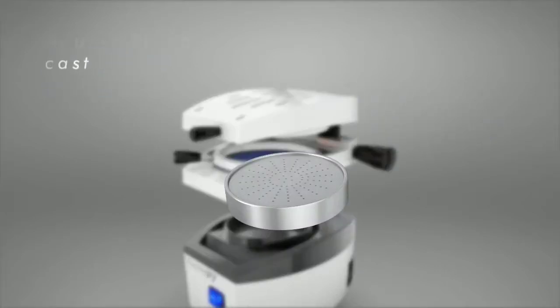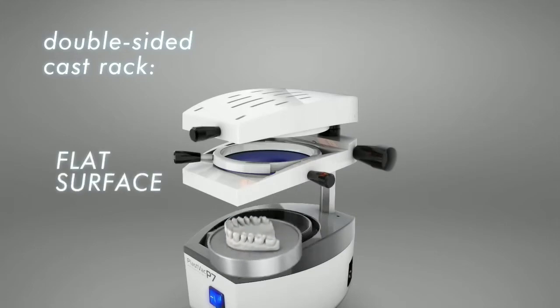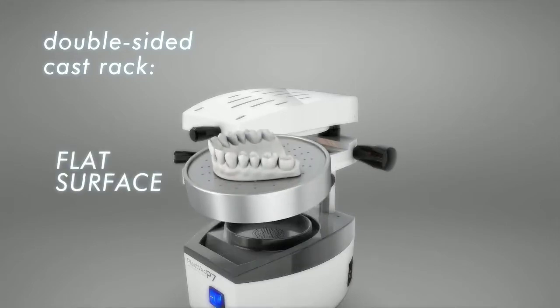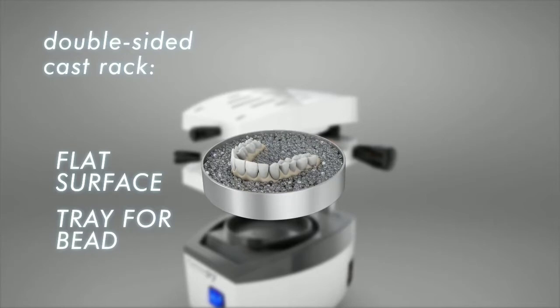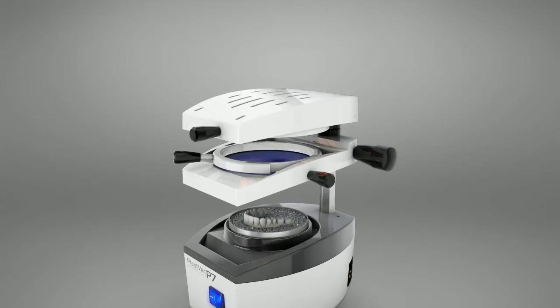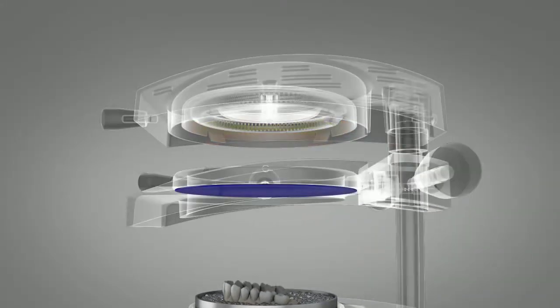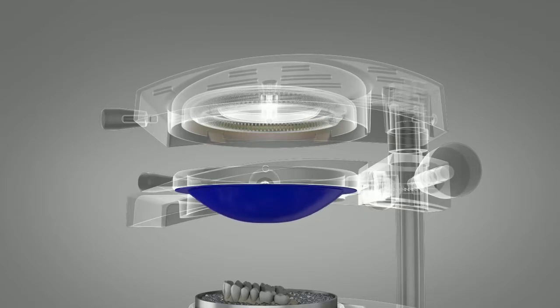It has a double-sided cast rack. The flat surface is indicated for soft sheets and casts with a good finishing. The tray for beads is indicated for hard sheets and non-finishing casts. Avoids sheets distortion, increases the airflow and facilitates the cast removal, avoiding cast breaking.